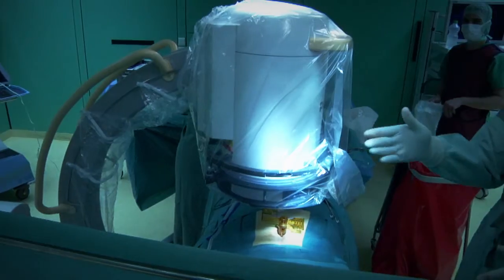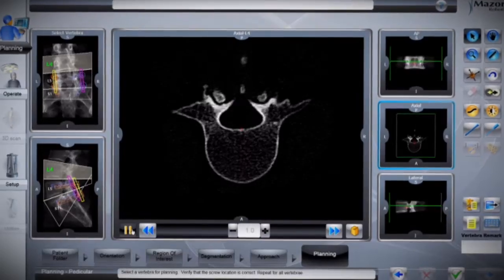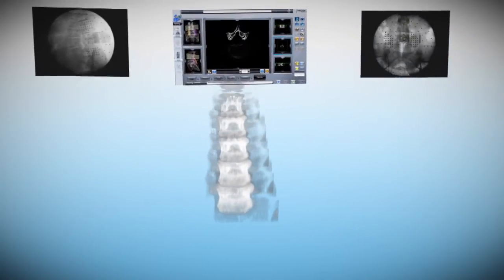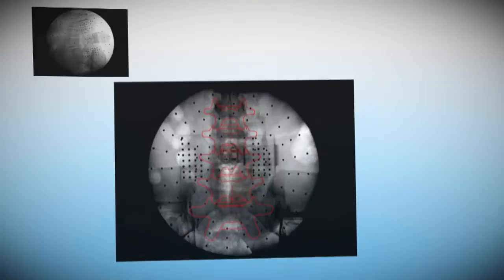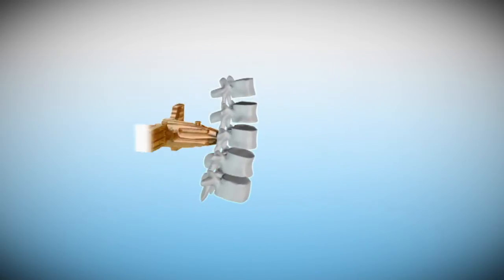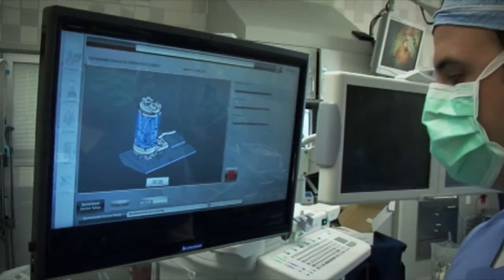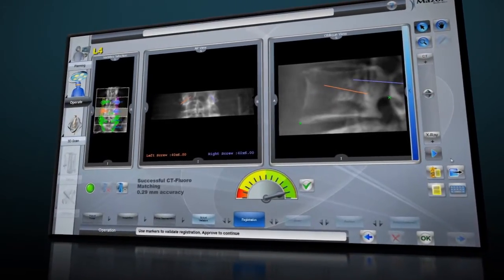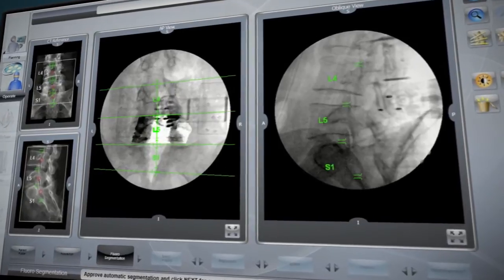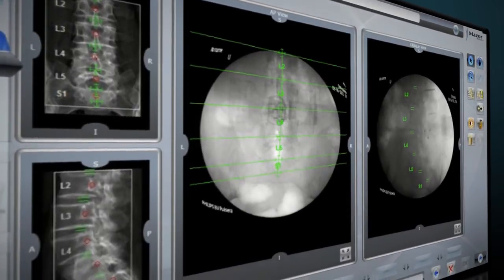Two fluoroscopic images of the 3D marker and spine are taken in AP and oblique views. Renaissance's software then automatically matches these intraoperative images to their corresponding location on the preoperative CT. This 3D sync process registers and synchronizes the CT-based surgical blueprint with the patient's spine and mounting platform, allowing the software to precisely match Renaissance's guidance unit relative to the patient's preoperative CT. Each vertebra is registered separately, independent of anatomical landmarks, so deformities, previous operations or changes in intervertebral spaces do not affect accuracy or performance.